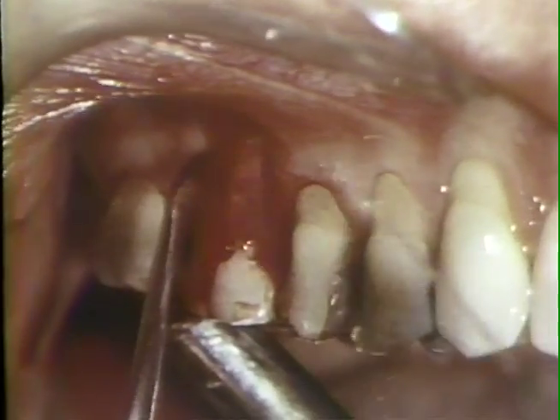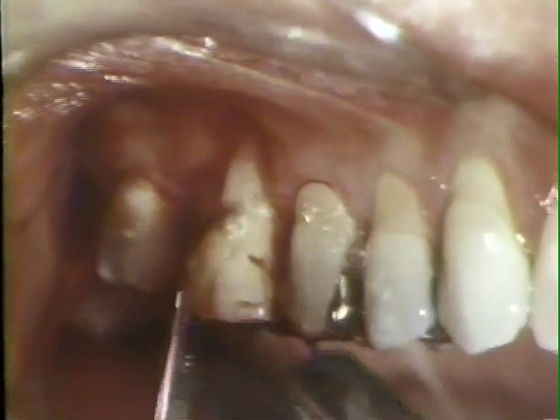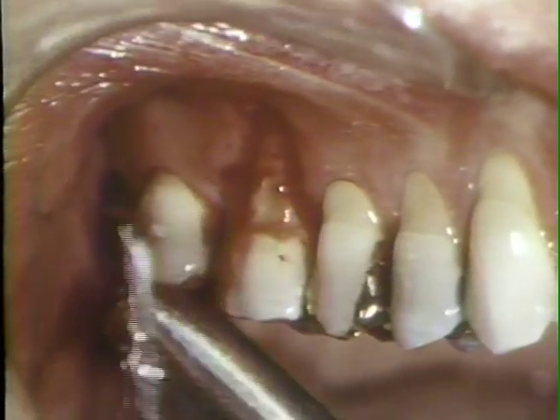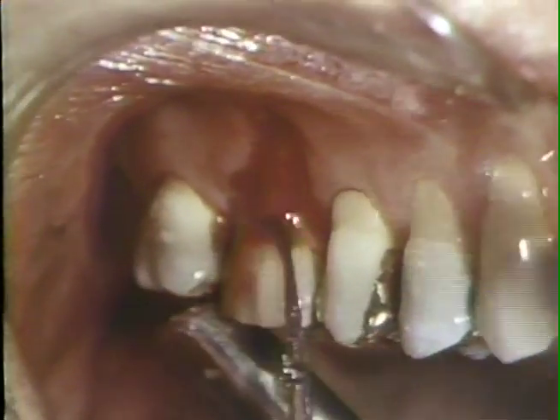The number 12 Goldman Fox instrument is used to plane the root surface and prepare the root for the laterally positioned flap, which will be taken from the second premolar.